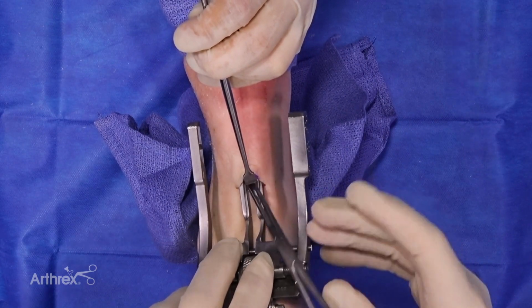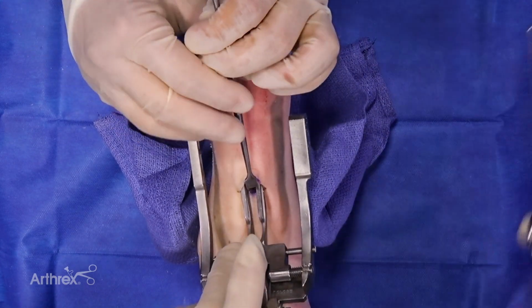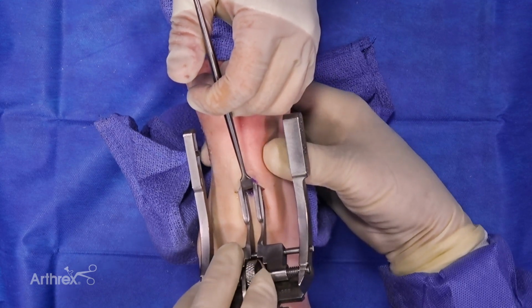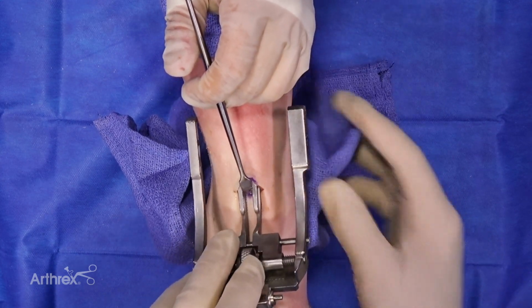Now, oftentimes people say, well, I put my sutures in and they slid out, I didn't capture any tendon. What usually has happened is that your device is too deep. It's too deep to the Achilles itself. You want to stay superficial.